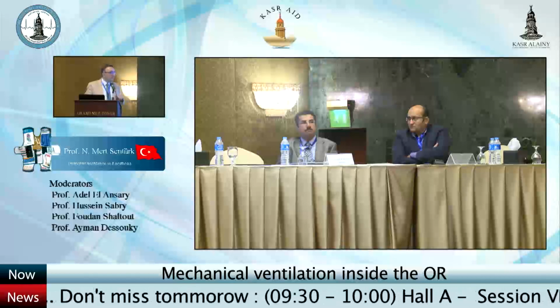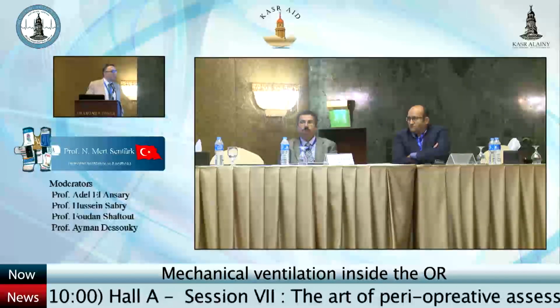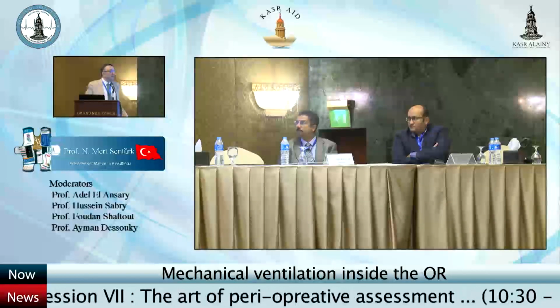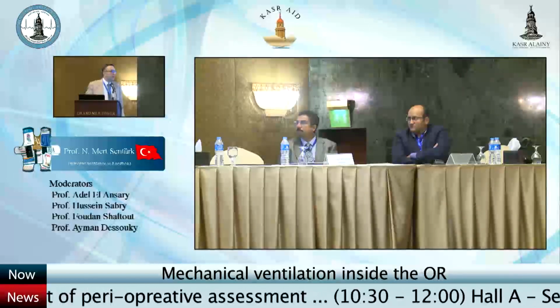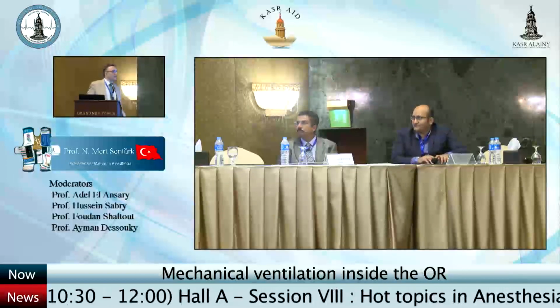But we use recruitment maneuvers. In thoracic anesthesia, I'm using the recruitment maneuver very often if I don't have any contraindication for it. And low tidal volume for sure, 6 ml per kilogram.